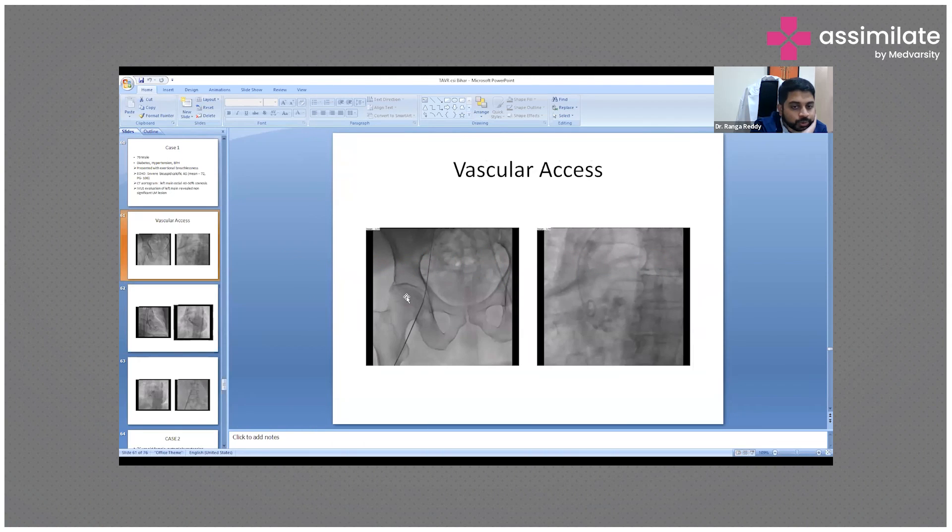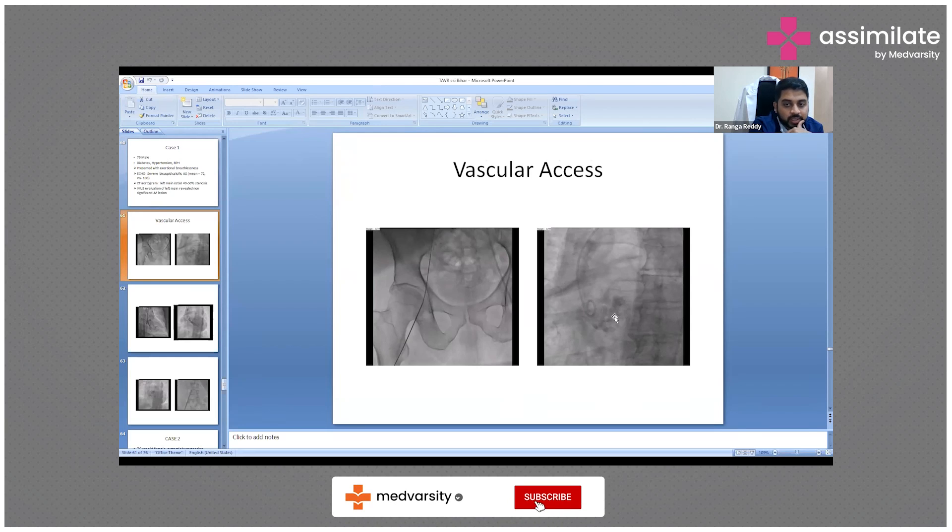These are the fluoro views. This is the femur, this is where we enter. We puncture the femoral artery and pass the wire across. The right side image shows the arch of the aorta, and this is the calcification of the aortic annulus on the aortic valve. This is a pigtail catheter where we check the annular plane.